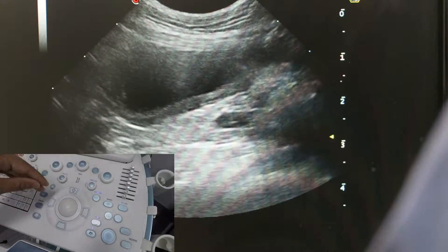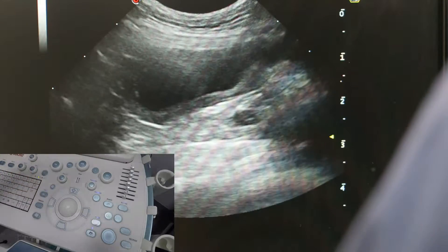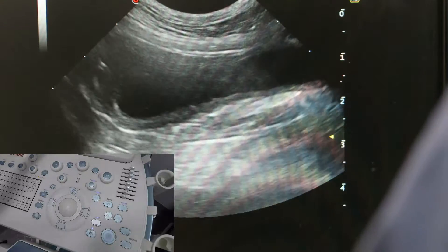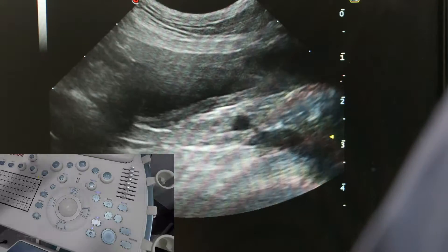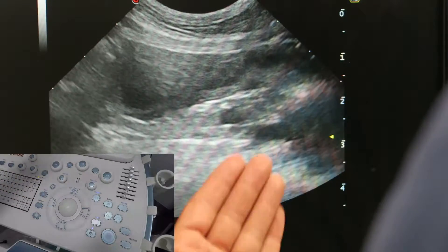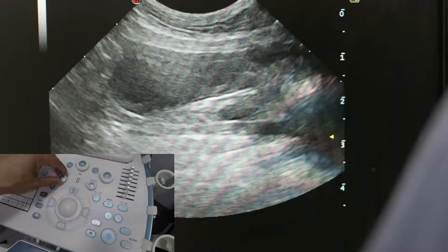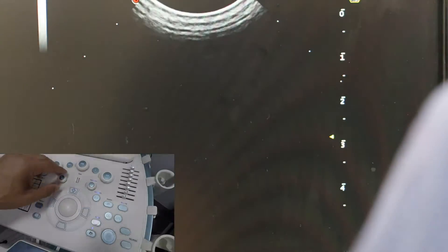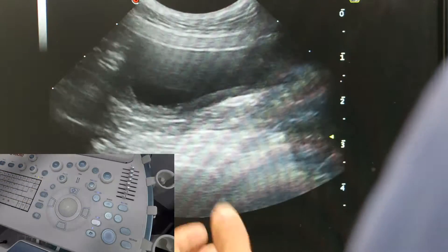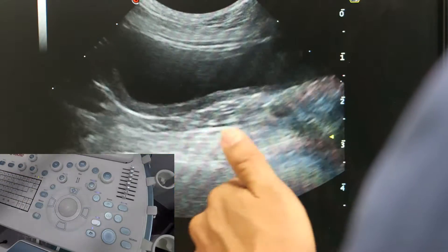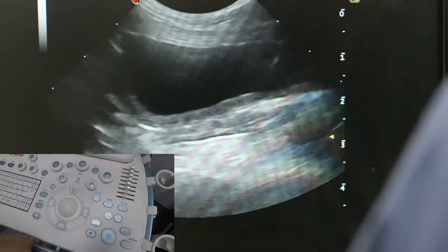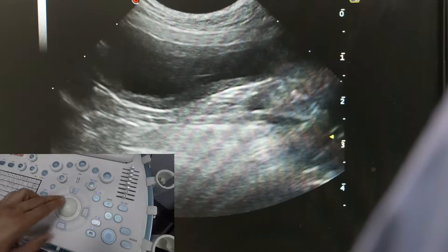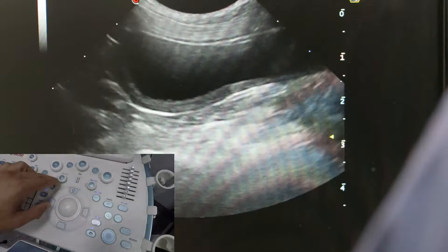The third thing is frequency. We adjust frequency last because we want the highest frequency possible when looking at a structure. The lower you drop the frequency, the more depth we get and the brighter the images become, but we lose resolution and image quality. So for the bladder — a superficial structure — we reduce the depth to just the bladder and a little below, adjust the focal point to just beneath it, then adjust the frequency, and this is the kind of image we get.